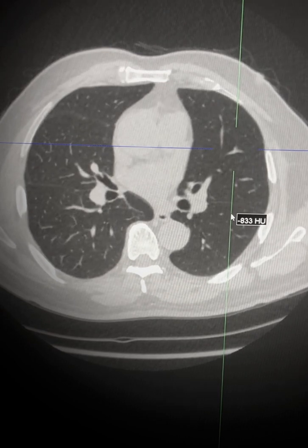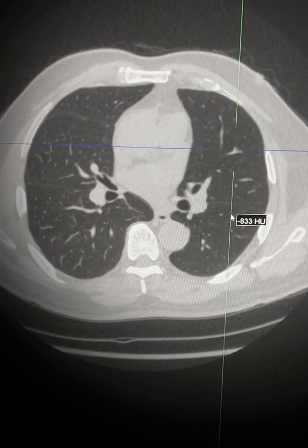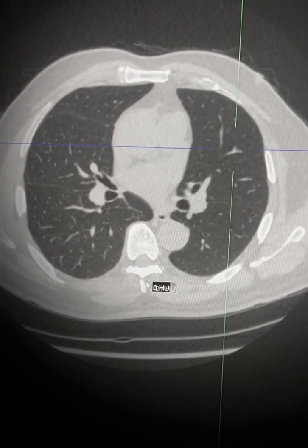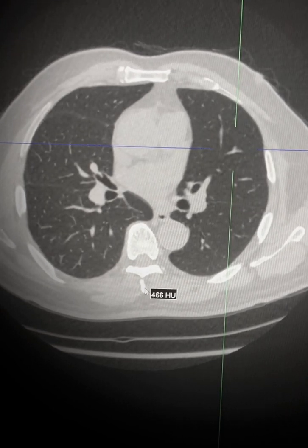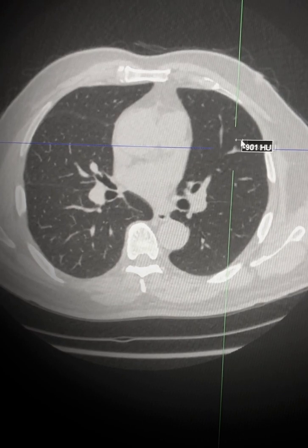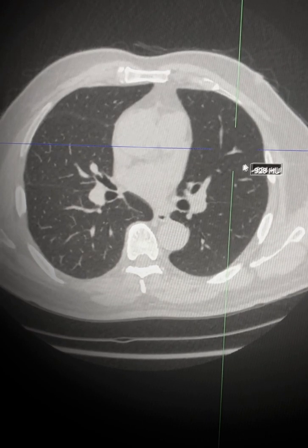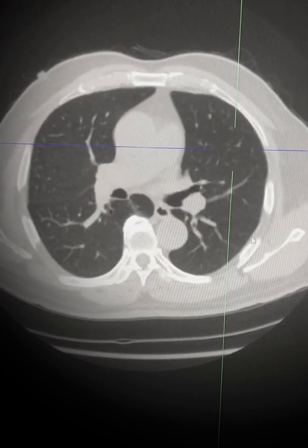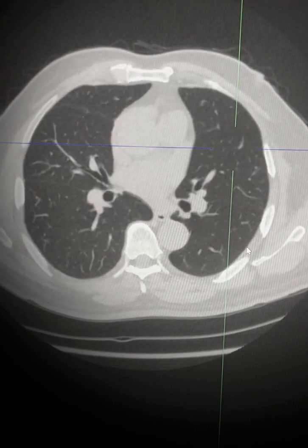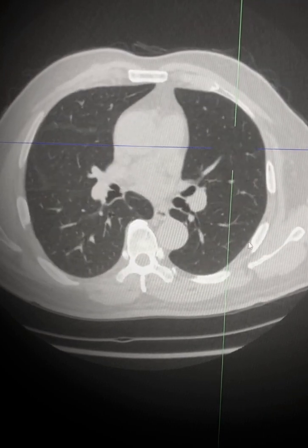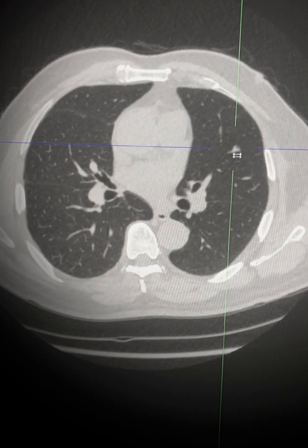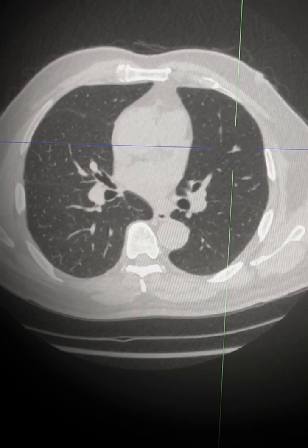We're going to use several of these on this scan and your attention is drawn to this area here. On very first glance it is difficult to determine whether there is an extra nodule in this position or not.